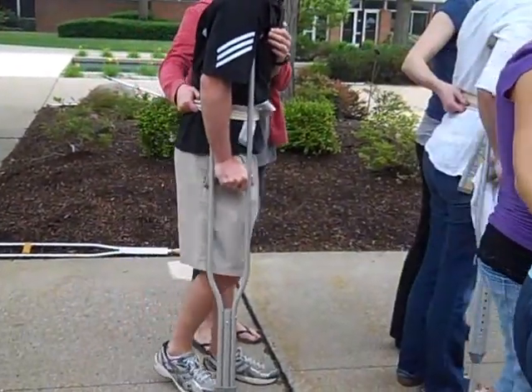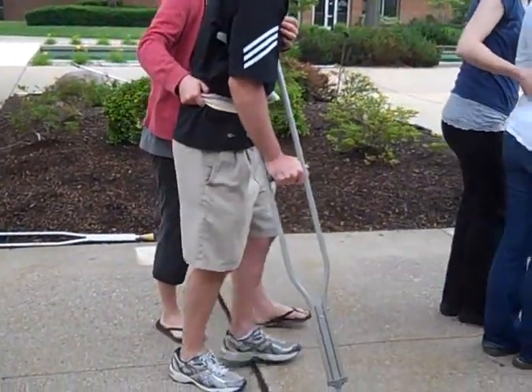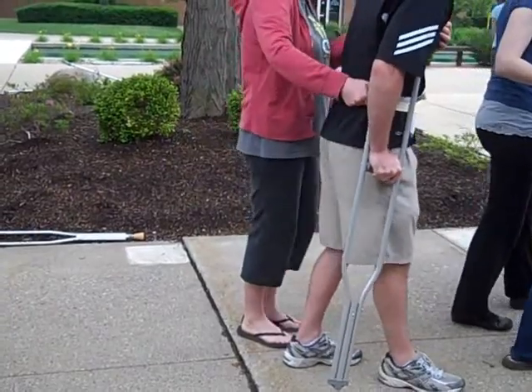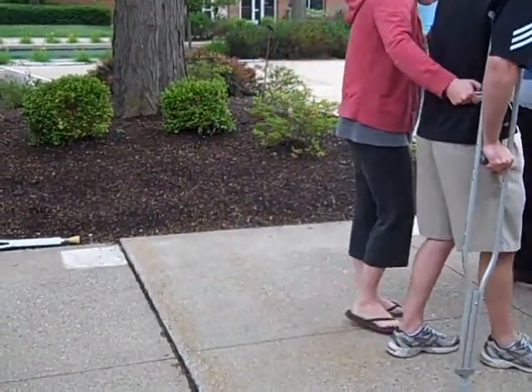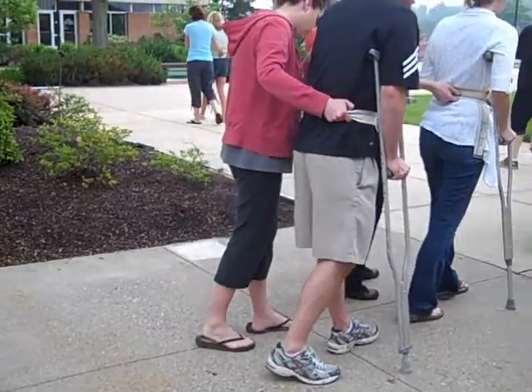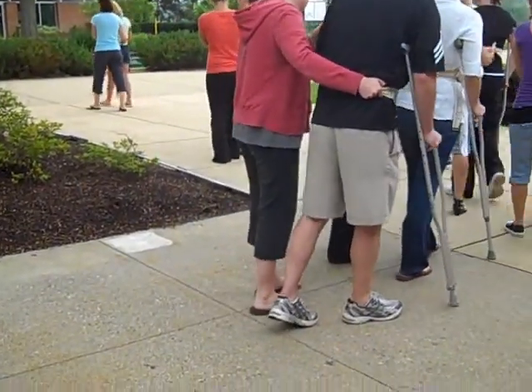Crutch. Crutch, involved foot, involved foot two. Crutch, involved foot two, other foot past.